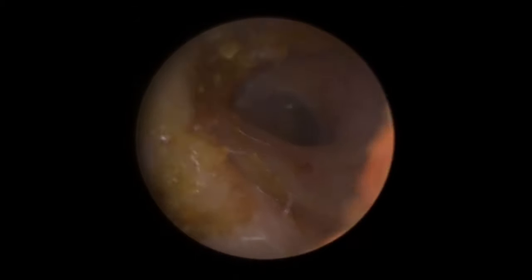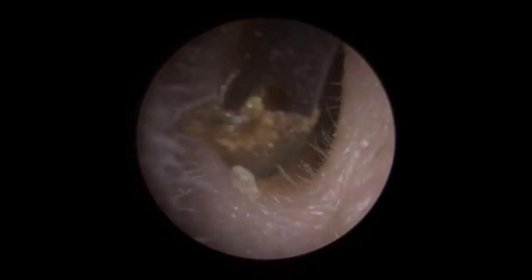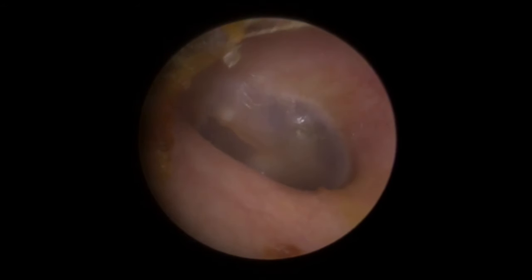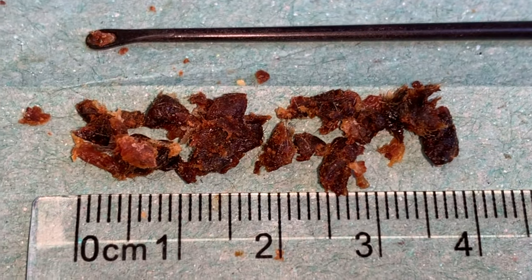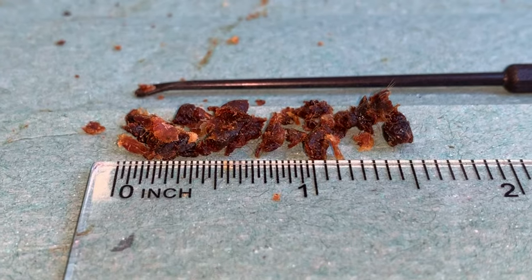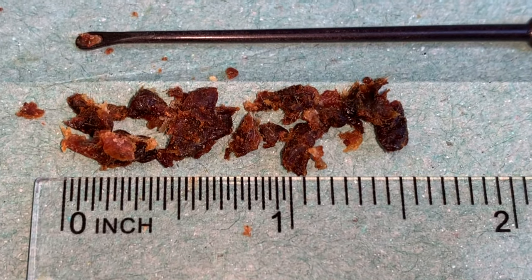There we go — we can see the eardrum there now. Let's just quickly clear this a little bit away on the left-hand canal wall. There we go — so we can see the eardrum there. This is what we removed — look at the colour differences. You've got very light to almost black. So we've got just under four centimetres of wax there — about an inch and a half of wax. Quite crumbly, dry stuff that one.